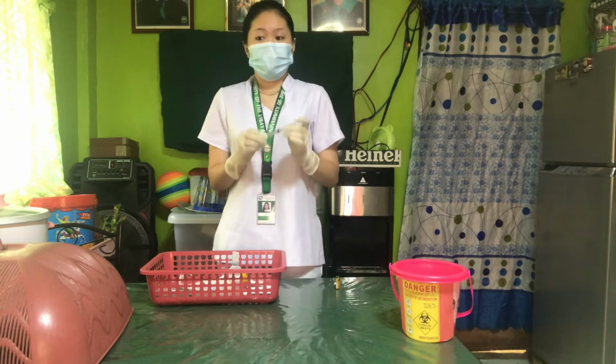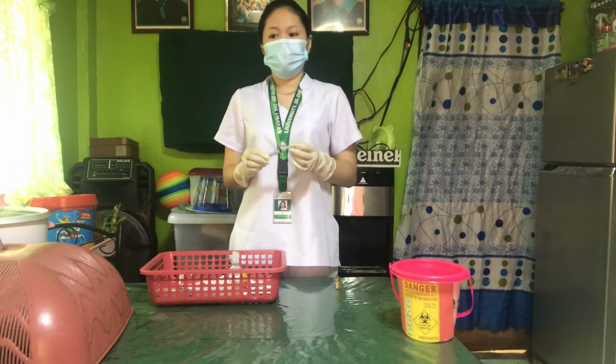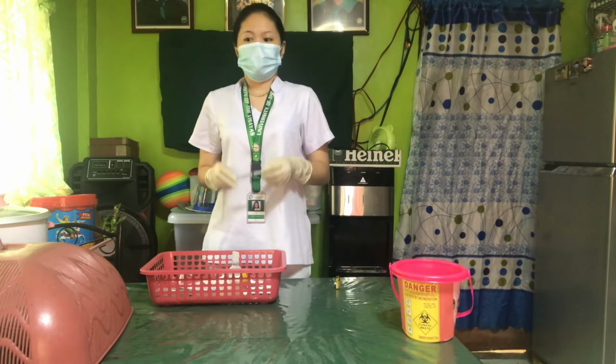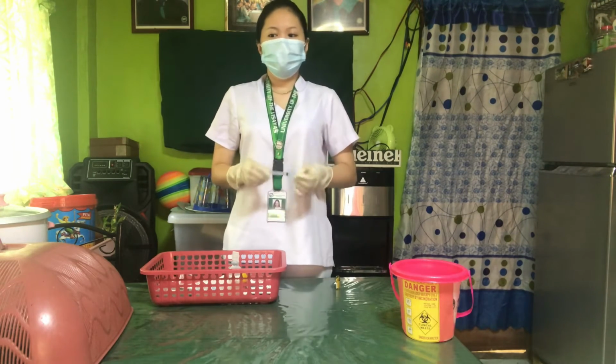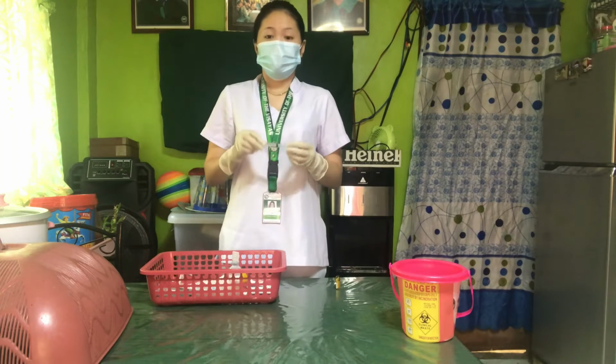Next is remove the cap from the filter needle and insert the needle into the center of the ampule. Ampules with broken rims are deemed tainted if the needle tip or shaft hits the rim of the ampule while it is inverted, the solution dribbles out.